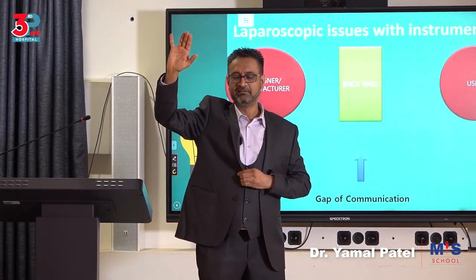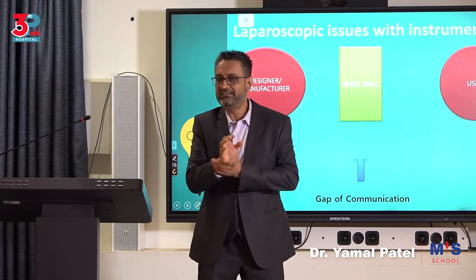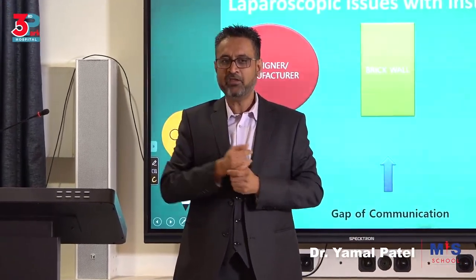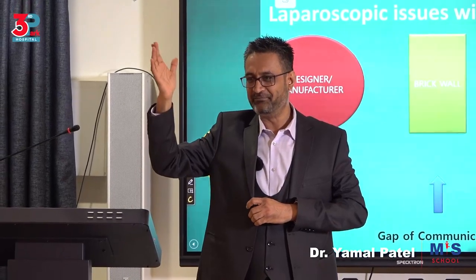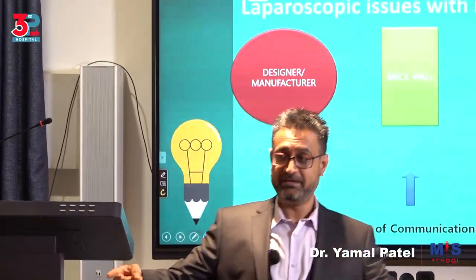6.5? So why are we using different size gloves? Because it fits better. Am I right? When you use the wrong size, does it not make it feel funny? How many of you have ever done laparoscopy with different sized instruments? Are they not all the same? They're standard, am I right? They're all 36 centimeters, and they're all the same handle.